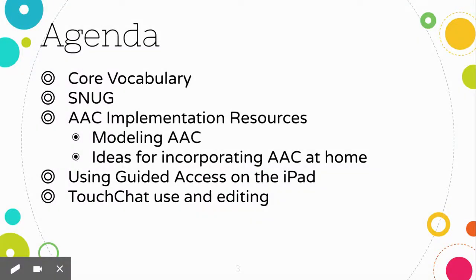Here's the agenda for this training. We're going to go over how the device is set up, our ultimate goal, which is SNUG, and how to use the device at home to help your child learn how to communicate. We're also going to look at using guided access on the iPad and editing within the TouchChat app.